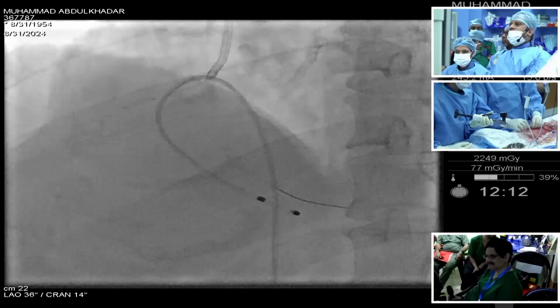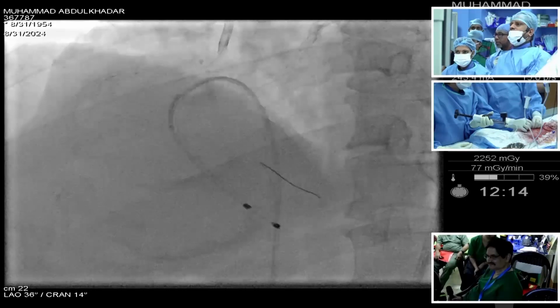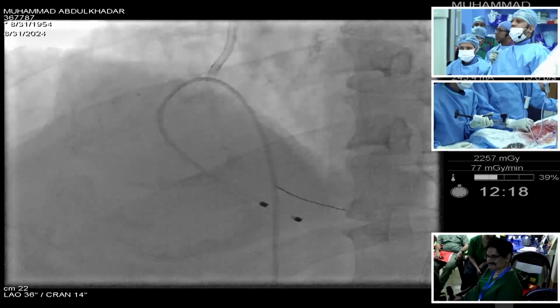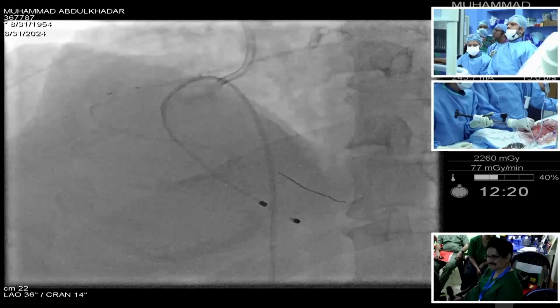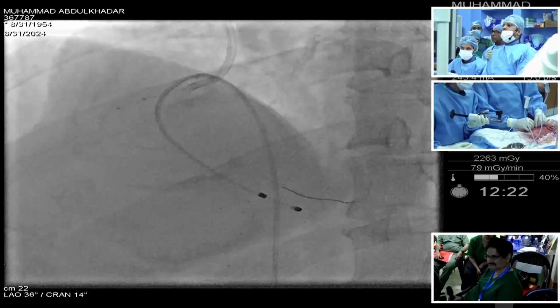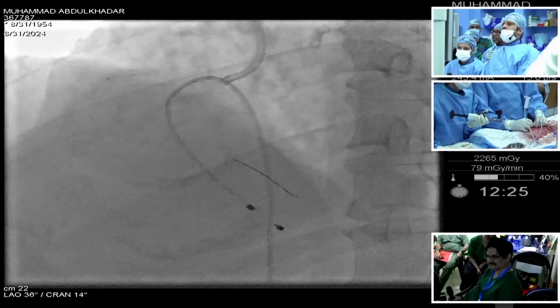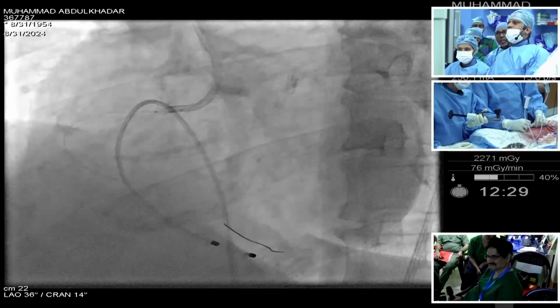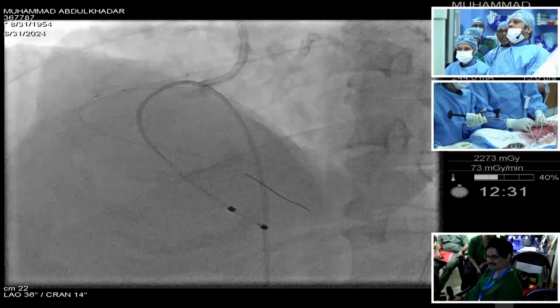But here, being a workshop, they are not very affordable. We would also want to keep the cost down. We thought we'd try with a non-compliant balloon. If it doesn't work, think about other options, things like that. So here, this is what we are trying. Did we open it up well at that particular area? It opened up well, right?